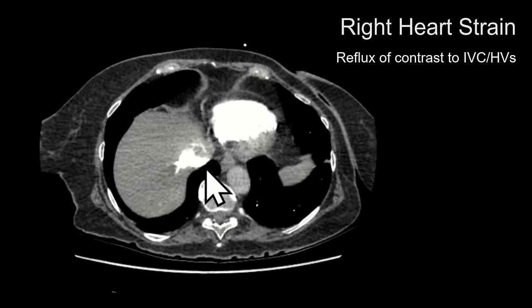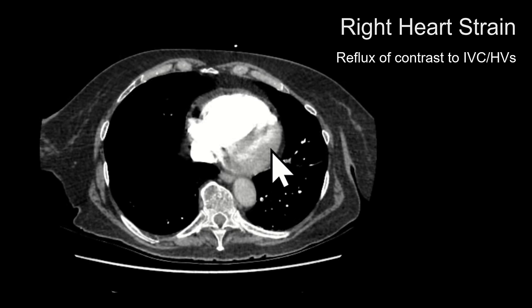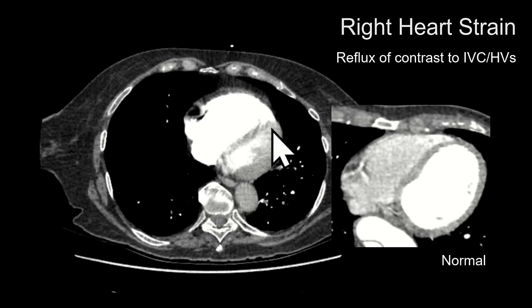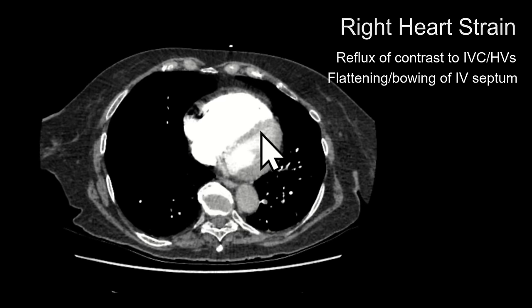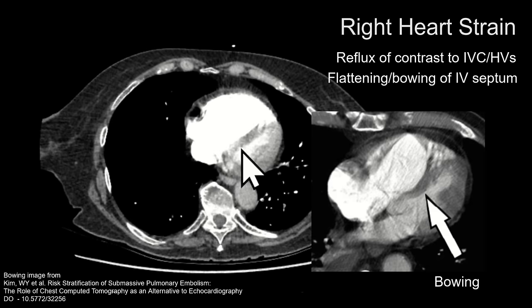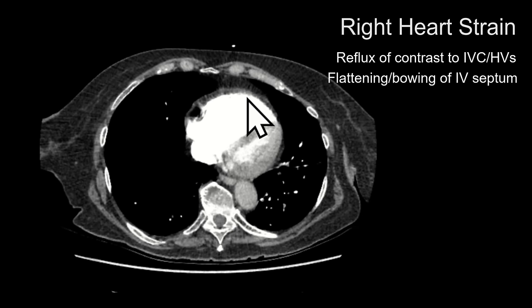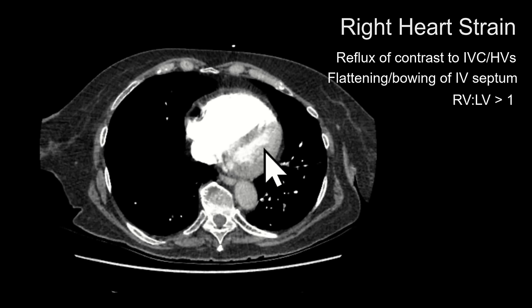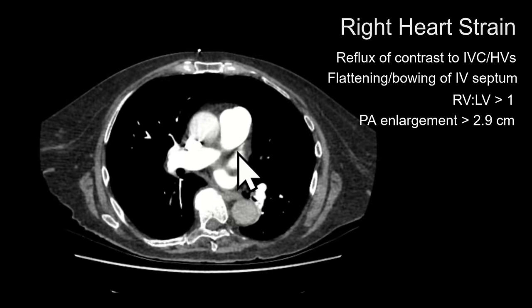Because pressures in the left heart are usually much higher than on the right, the left ventricle usually has a convex impression onto the right ventricle. With right heart strain you may see flattening of the interventricular septum or even bowing towards the left ventricle. With increased pressures in the right heart, the right ventricle can increase in size — if the RV-to-LV ratio is greater than one, that is also a CT finding of right heart strain, along with enlargement of the pulmonary artery.